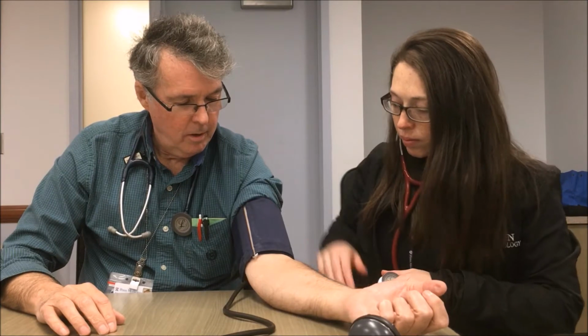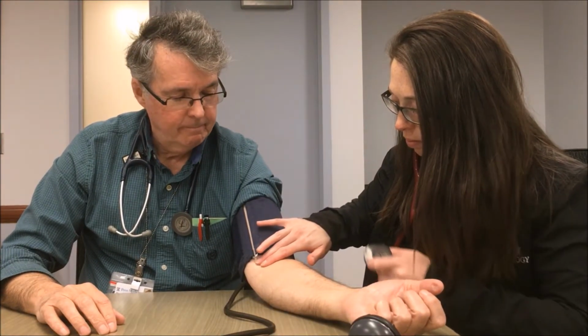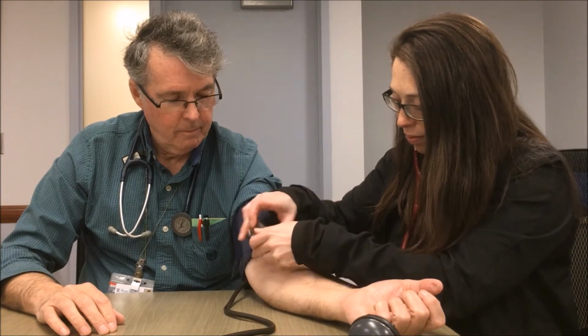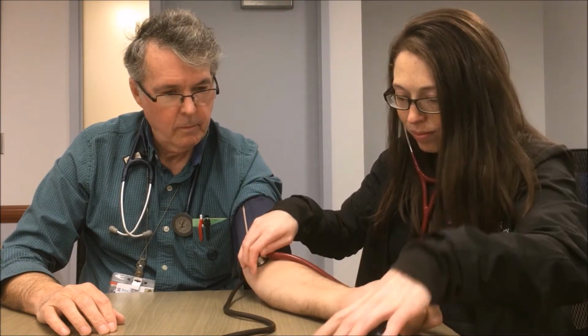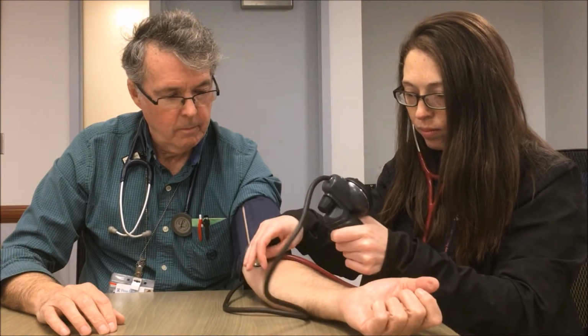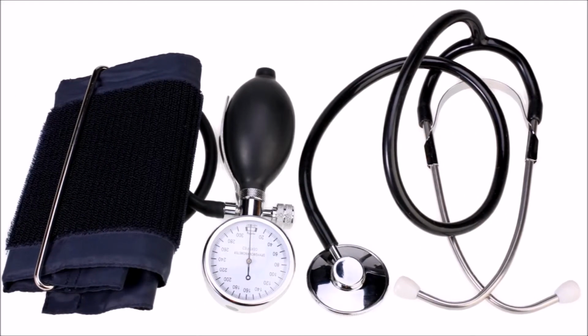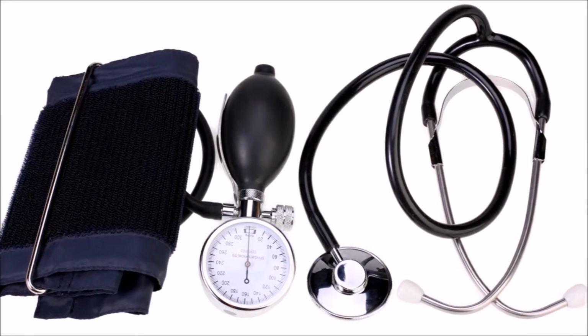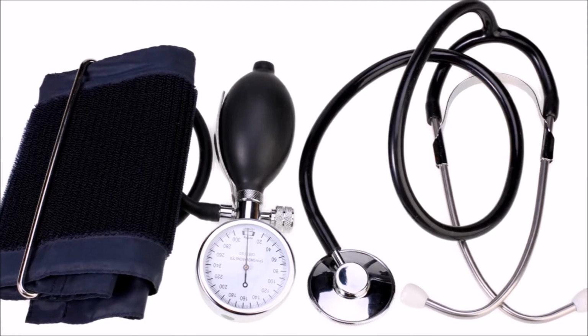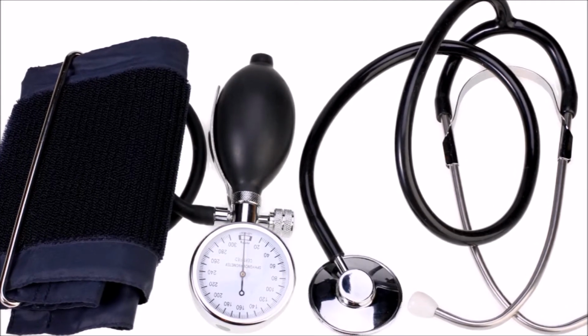for all patients. American Heart Association publications recommend validation on each individual patient before a blood pressure monitor is used for hypertension management. That means to compare the device readings with auscultatory blood pressures and to check if the difference is acceptable. Auscultatory blood pressure is traditionally measured with a blood pressure cuff and a stethoscope. The medical professional uses the stethoscope to listen to the Korotkoff sounds from blood flow during cuff deflation.